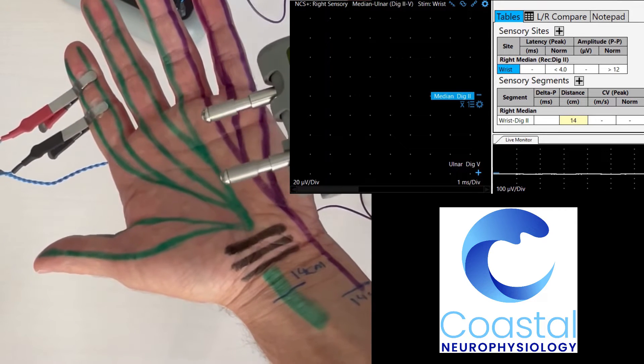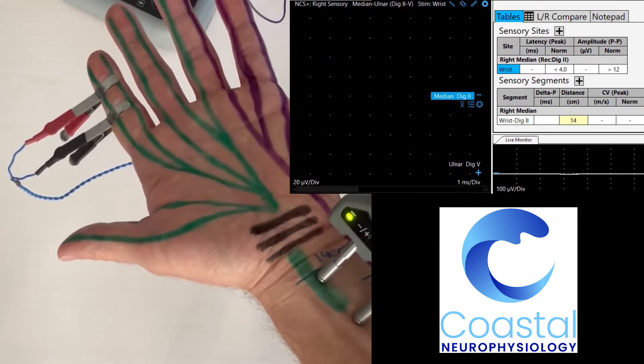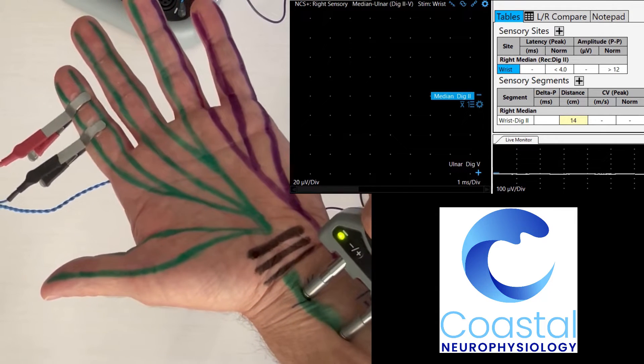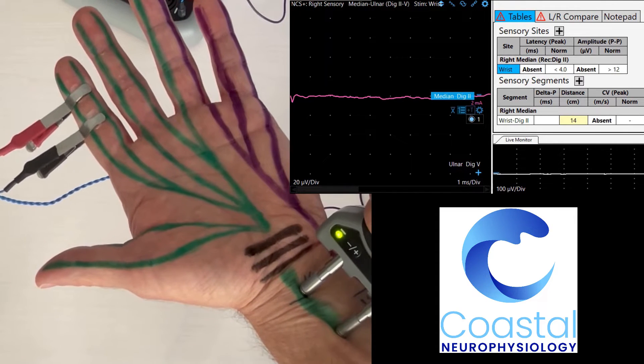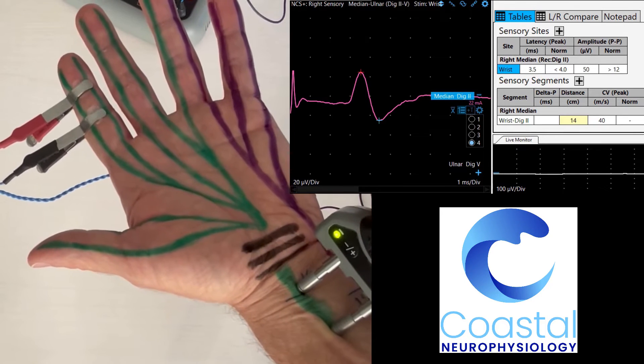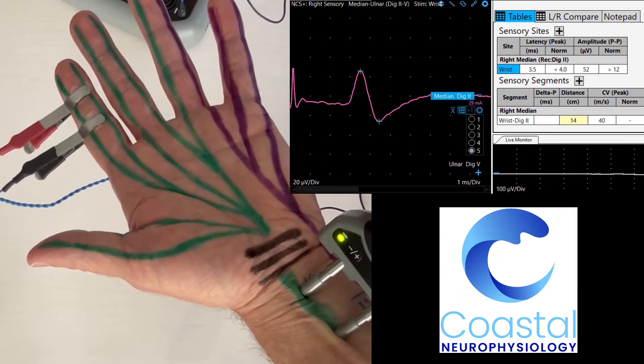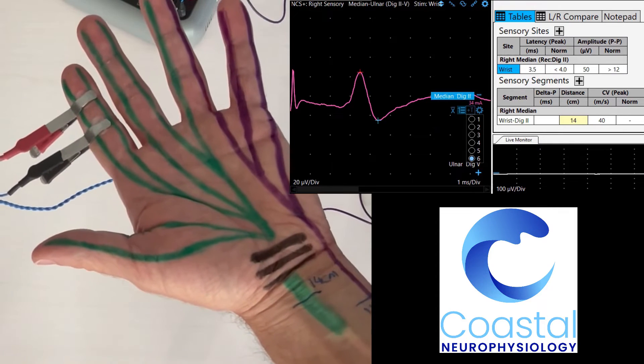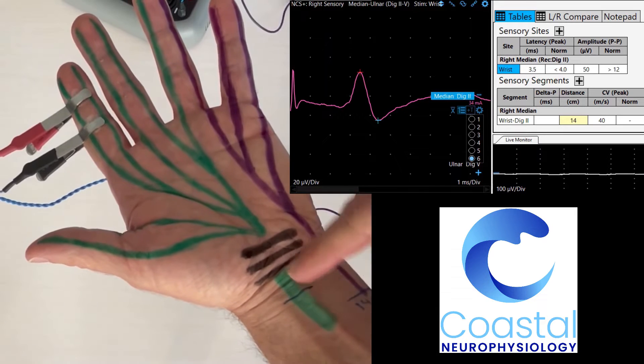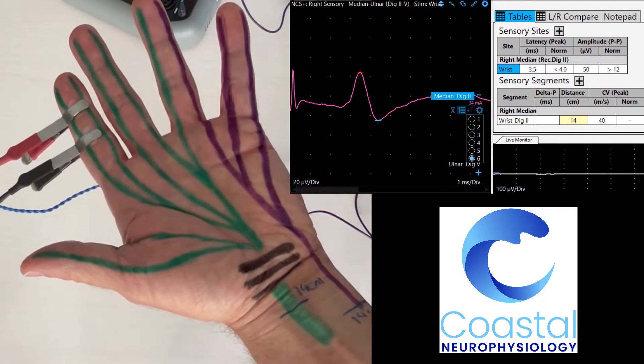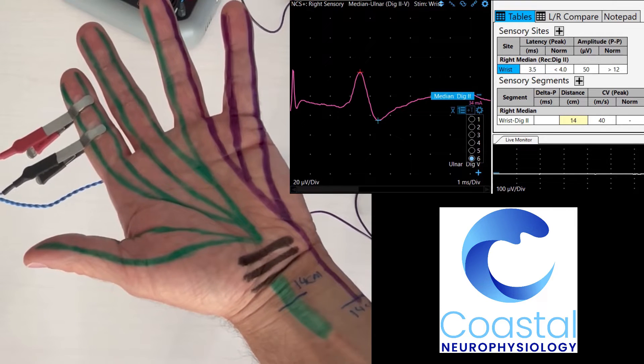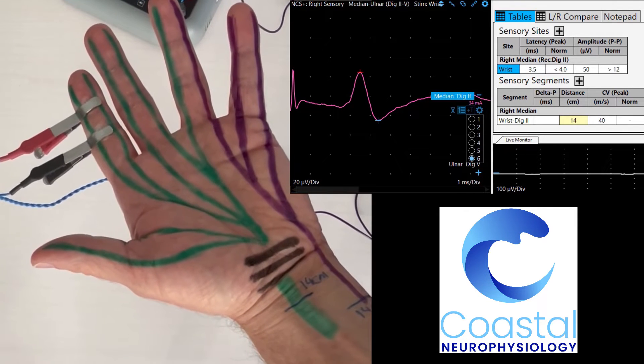If I take an electrical stimulator here and stimulate my median nerve at a set distance of 14 centimeters, which is a common distance used, and progressively stimulate the nerve, you will then see in the electrical recording that I have created a waveform on my screen. This is a sensory nerve action potential. That is the signal where it leaves here and reaches the electrodes in the finger. We record the signal at a couple of different points and you can see a mark, an X mark in red, at the top of that waveform.